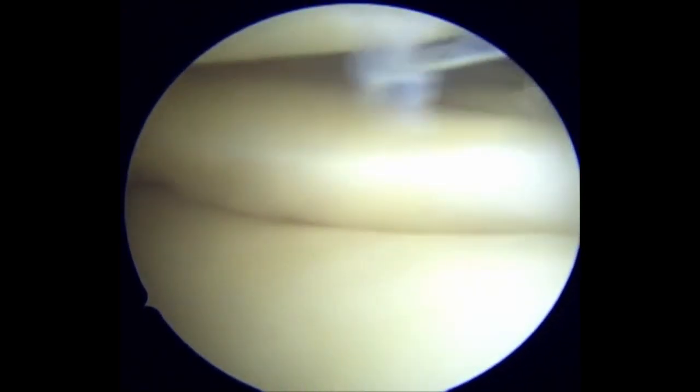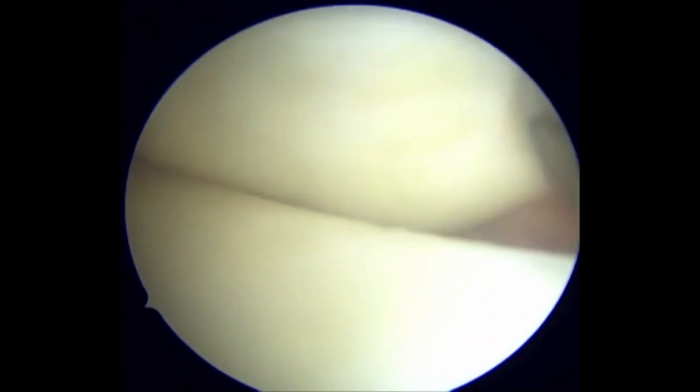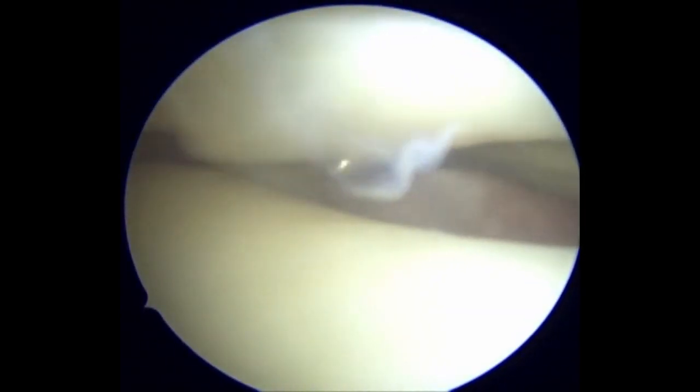The probe is used to lift up the posterior horn to inspect the thickened undersurface of the posterior horn. The displaced flap can be seen in the meniscus tibia recess. The ragged edge of the flap suggests there is some chronicity to the lesion. The displaced flap is being reduced back into the knee joint with the probe.